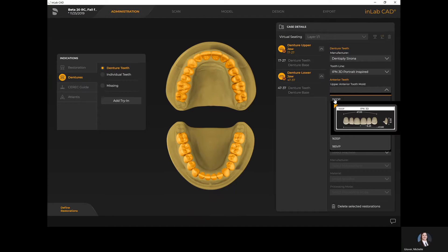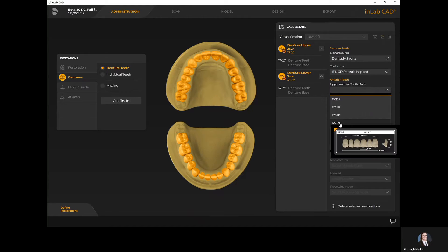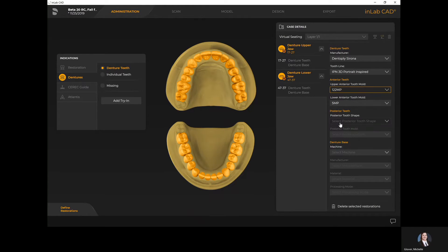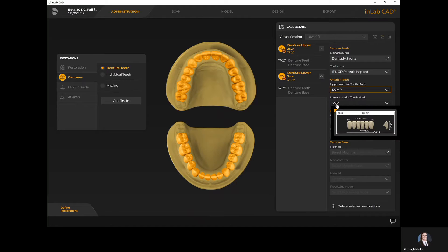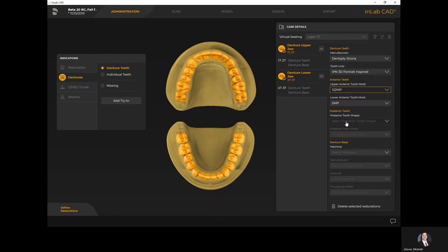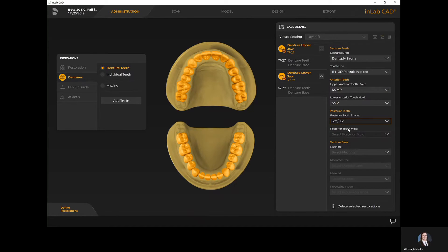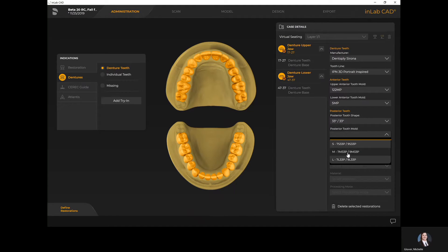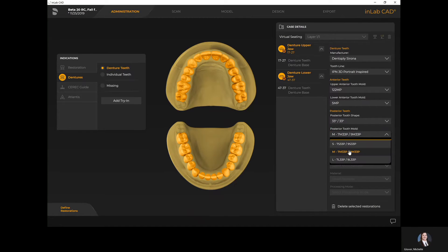I'm going to use the denture teeth. Much like in software 20, when you hover over the teeth it gives you a preview of what the mold actually looks like. They are pre-occluded libraries with the IPN 3D teeth, so when you select your upper mold it automatically gives you the lower. Here I'm selecting my type of occlusion — either balanced or lingualized — and I've selected my 33 over 33 for balanced with a medium mold, which gives me the upper molds with the opposing lower.